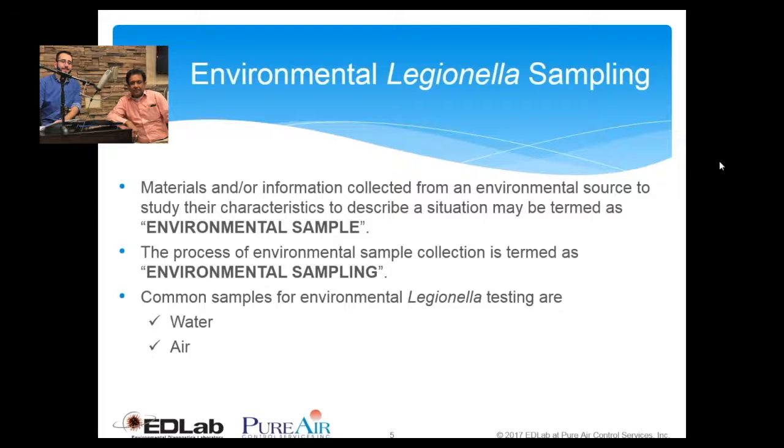All right, so now we'll go ahead and begin part 3 of our webinar. Dr. Sahai, can you explain what environmental samples and sampling are? Yeah, sure. That's the first thing one should know, because there is definitely a difference between testing a sample collected from the clinical specimen versus the environmental specimen.